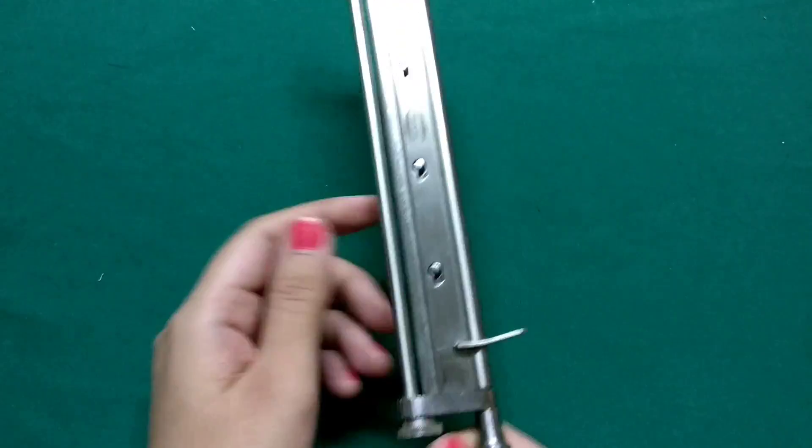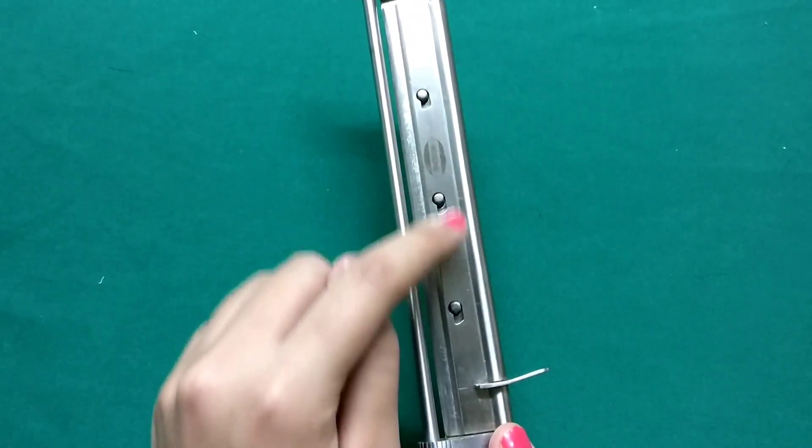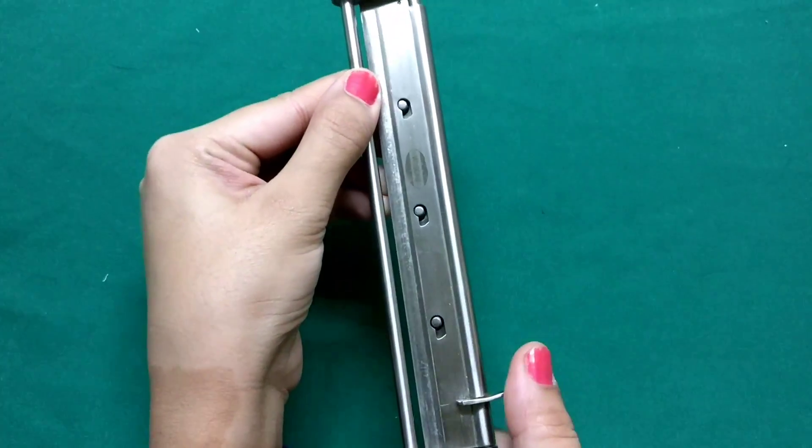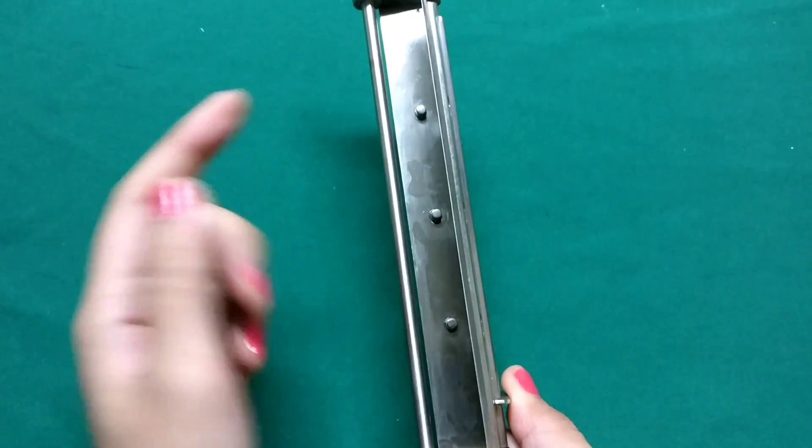So this is the way we hold a skin grafting handle. These are the openings from where we have to open this flap and this is how we introduce the blade.